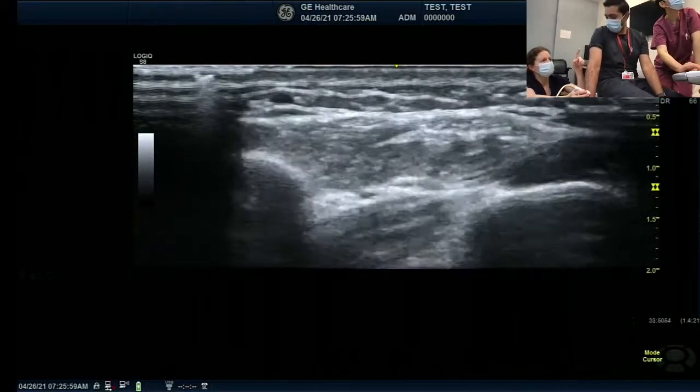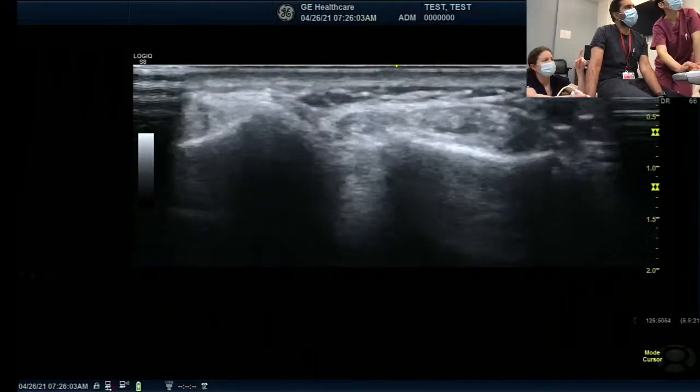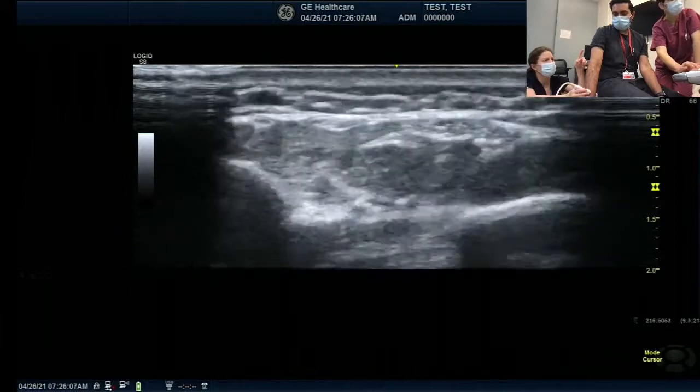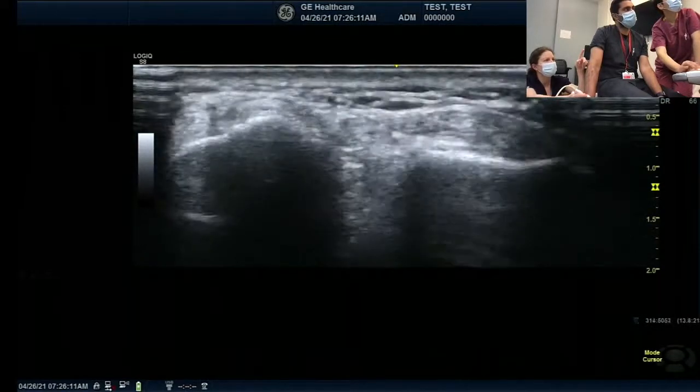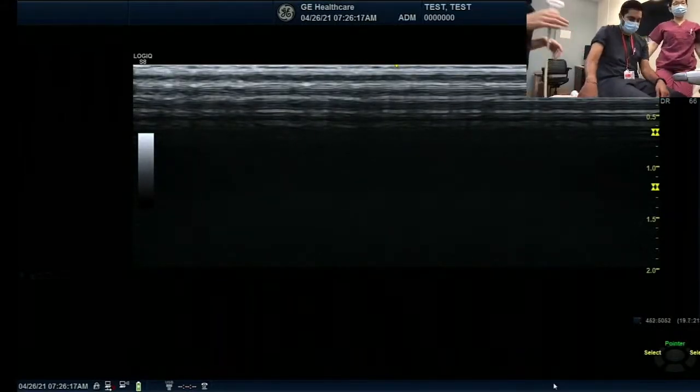If I move faster, then... Yeah, can you move a little faster? Yeah, so I'm going to go up and see now. Here, actually, it does follow what we're talking about. Exactly. Yep. Let me try to straighten my wrist. Okay. Now your turn. Okay, now Divas is going to practice.